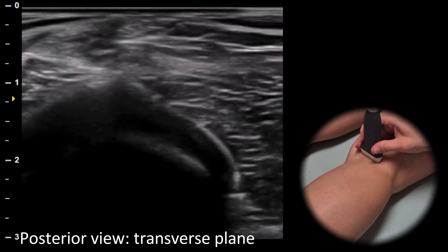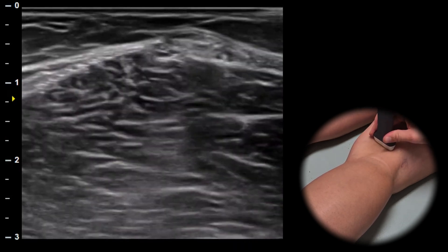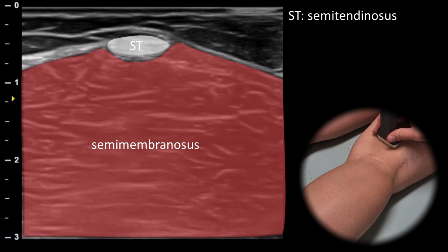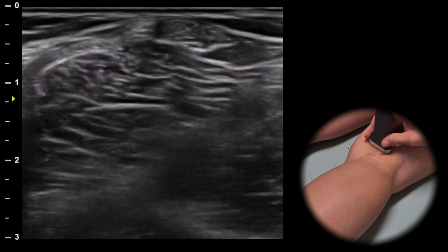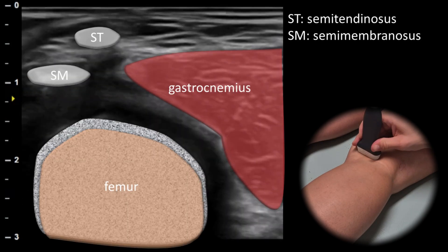The last view is the posterior view. In the transverse plane on the medial side we can evaluate the semimuscles. The tendon of the semitendinosus lies superficially to the muscle belly of the semimembranosus. A metaphorical comparison for these muscles is a cherry on a cake, where the cherry represents the semitendinosus tendon and the cake represents the semimembranosus muscle. When we follow these structures distally we reach the area between the gastrocnemius muscle and the tendons of the semimuscles, where we can scan for a Baker's cyst.